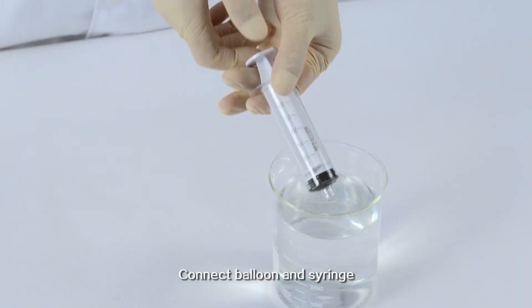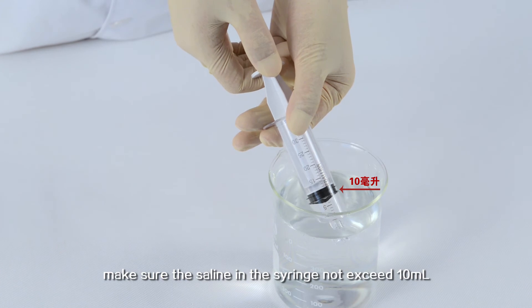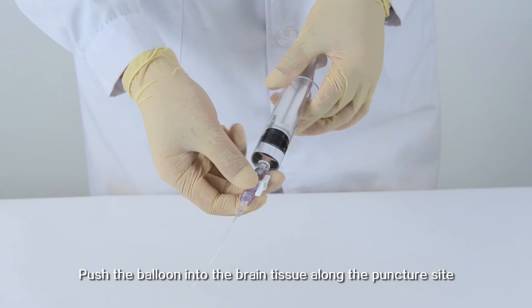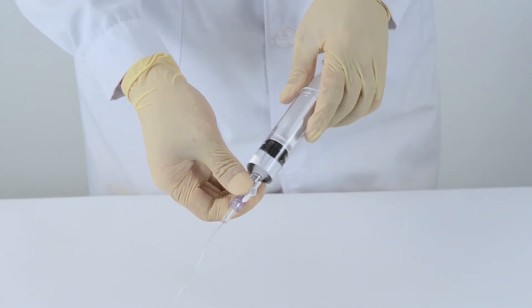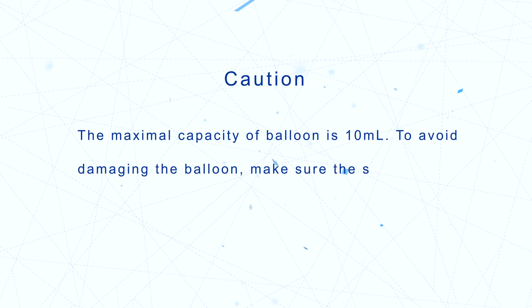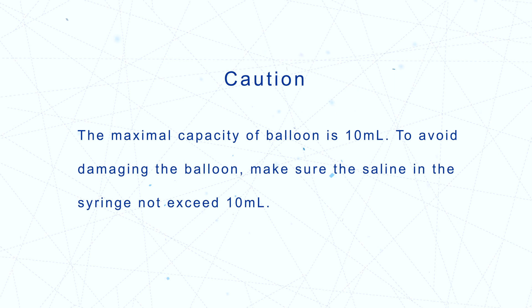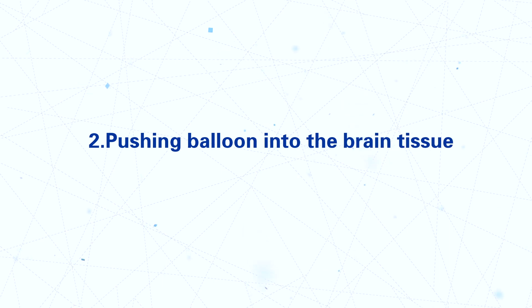Connect the balloon and syringe, making sure the saline in the syringe does not exceed 10 ml. Push the balloon into the brain tissue along the puncture site. Caution: the maximal capacity of the balloon is 10 ml. To avoid damaging the balloon, make sure the saline in the syringe does not exceed 10 ml.